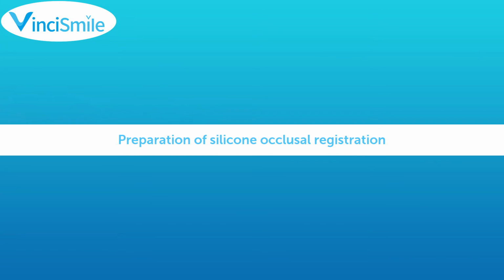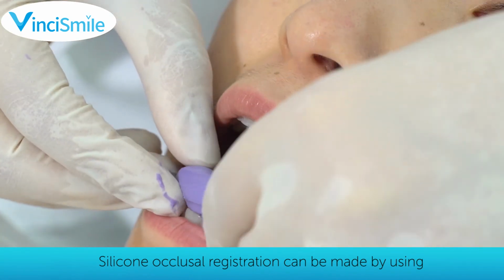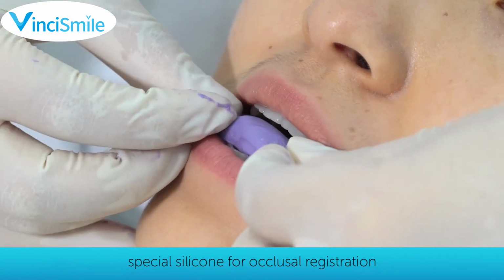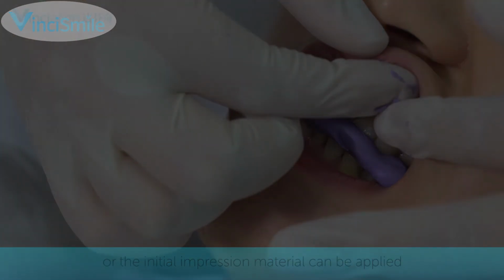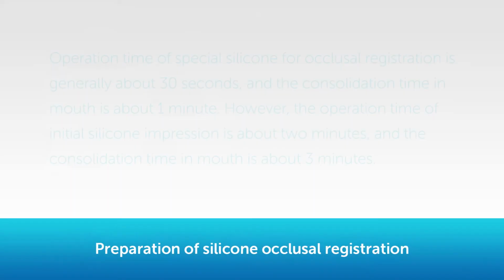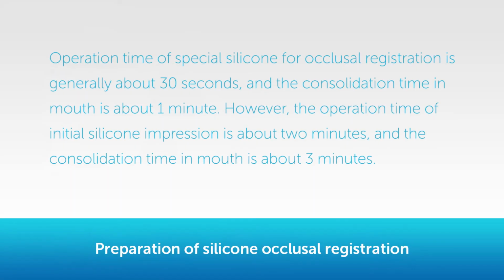Preparation of silicone occlusal registration. Silicone occlusal registration can be made by using special silicone for occlusal registration, or the initial impression material can be applied. Operation time of special silicone for occlusal registration is generally about 30 seconds, and the consolidation time in mouth is about 1 minute. However, the operation time of initial silicone impression is about 2 minutes, and the consolidation time in mouth is about 3 minutes.